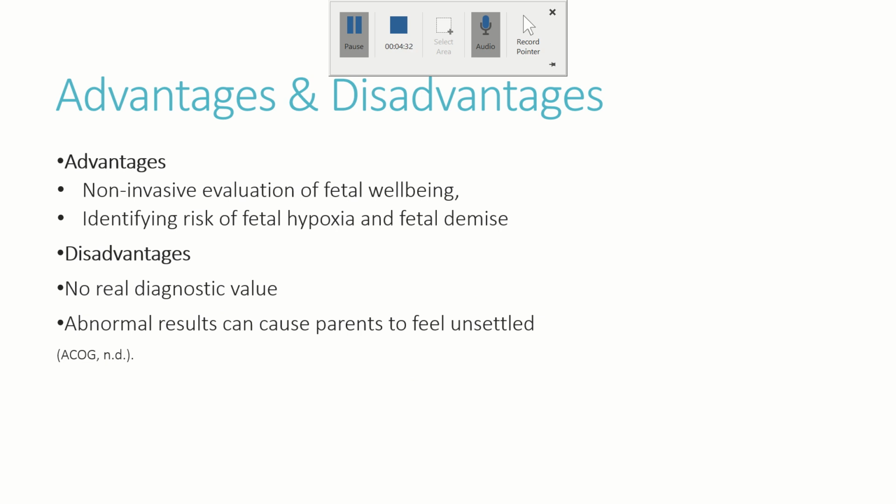The advantage of the NST is that it's a non-invasive way to evaluate fetal well-being. It allows providers to identify the risk of fetal hypoxia and fetal demise. This type of test is so non-invasive, though, it can be seen as a disadvantage. This is because it doesn't give us much information, as there is no real diagnostic value associated with the test.